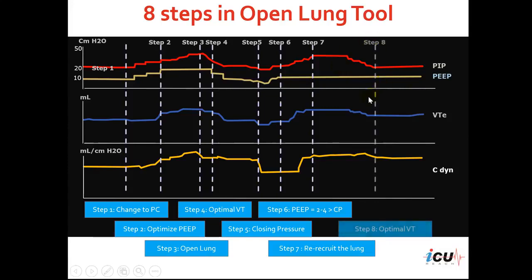The final stage would be to achieve the target tidal volume once again. We maintain the re-recruitment for 2 minutes, then start going down gradually on the pressure control level to achieve the tidal volume optimal for the patient's ideal body weight — 6 ml per kg. Once we achieve that tidal volume, we maintain the ventilator with the new peak inspiratory pressure and the new optimal PEEP.